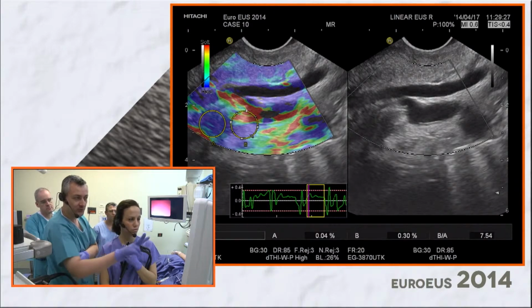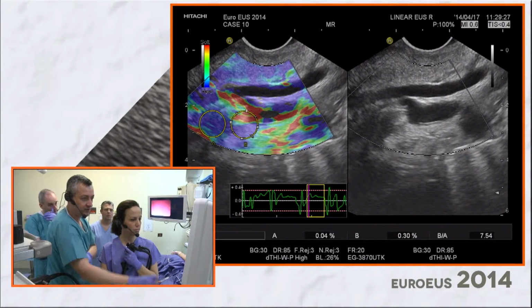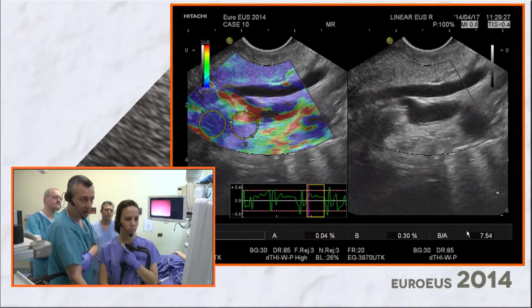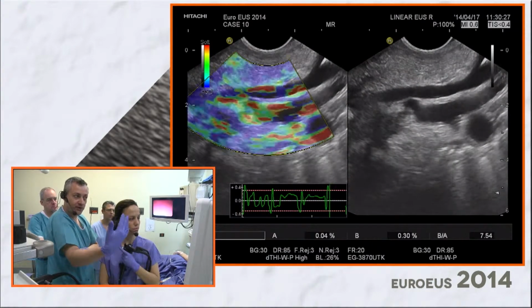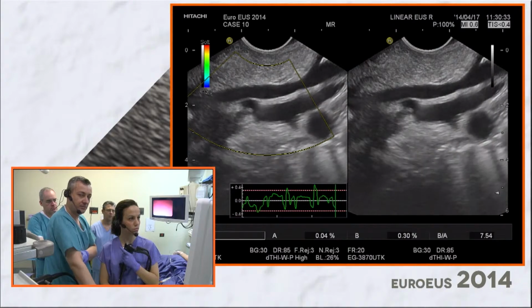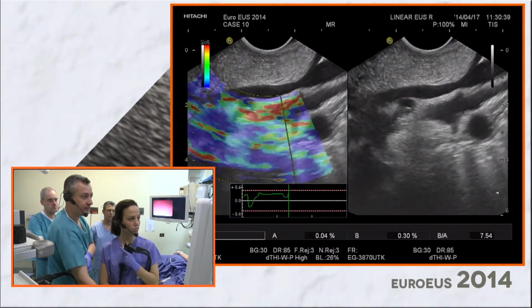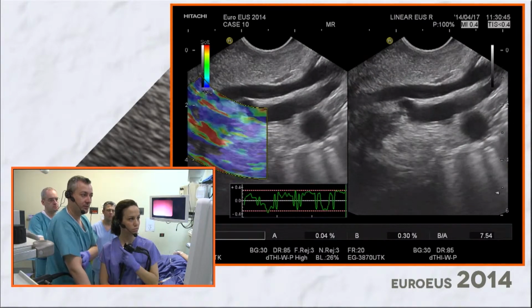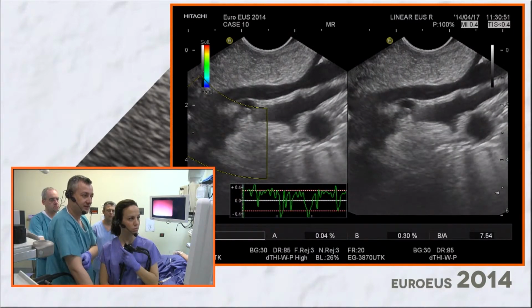There are various ways to do it. In one of the studies they used two regions of interest, one at the same depth. And you see that the values of the strain ratio are 7.54, so it's pretty hard. You see it again, it's a bit difficult for elastography because it's a profound lesion. It's towards the 3-4 centimeter limit, but nevertheless you can change the elastography region of interest to avoid some of the vessels, and then you can try to get better images. You need to have some patience, but it's pretty quick, so you can get some answers in a few minutes.